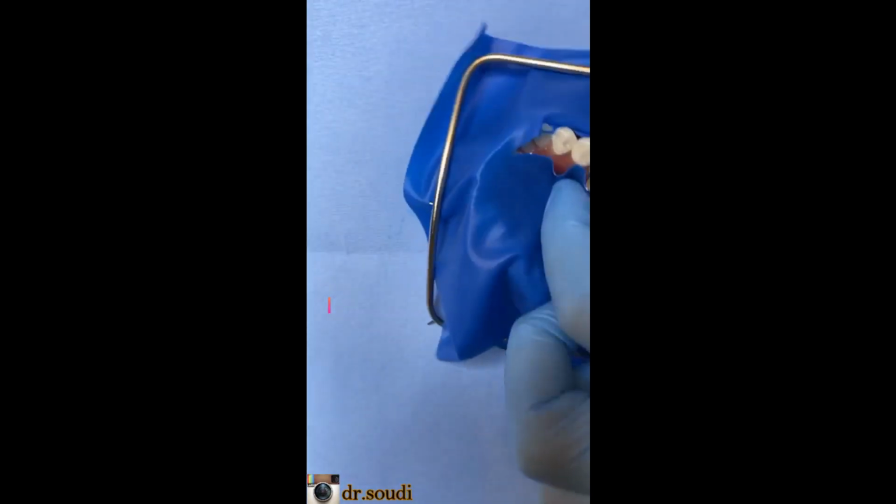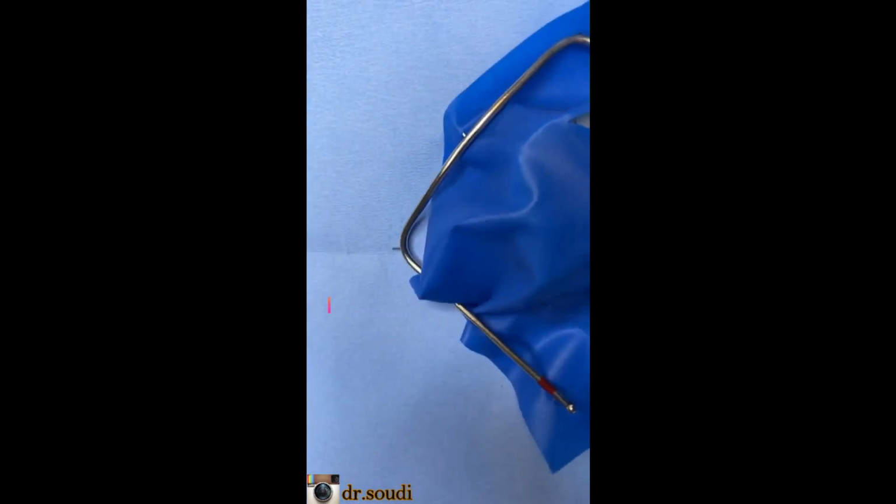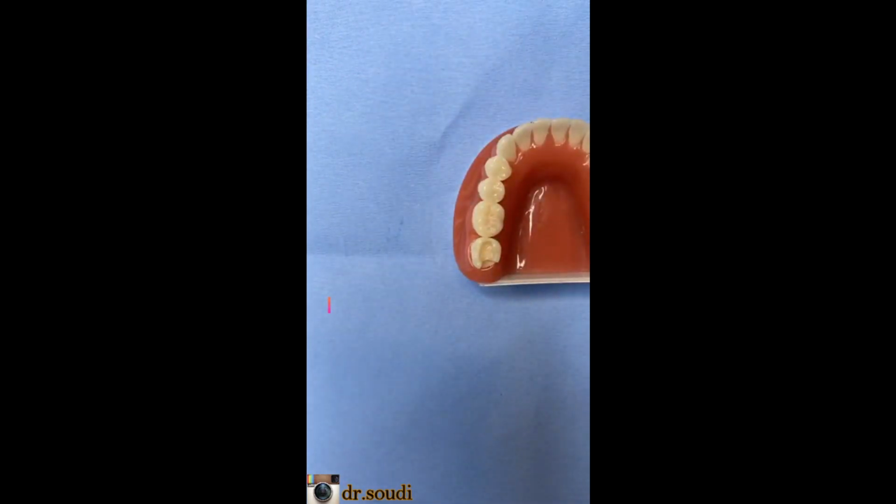Okay, so if I have a tight contact, I should place a wedge first. Okay, and I don't have wedge now, sorry. Okay, I can have the other sheet.